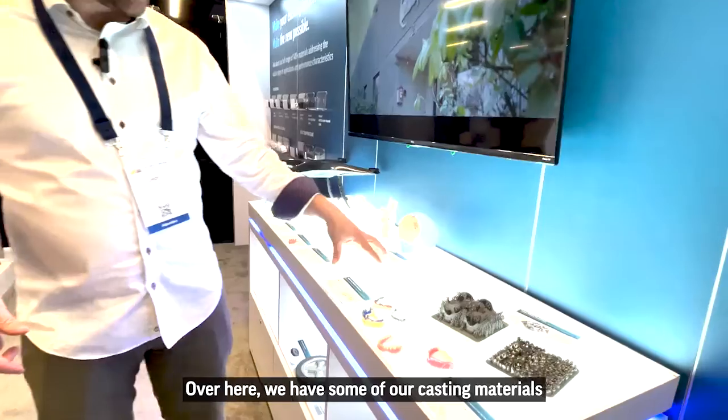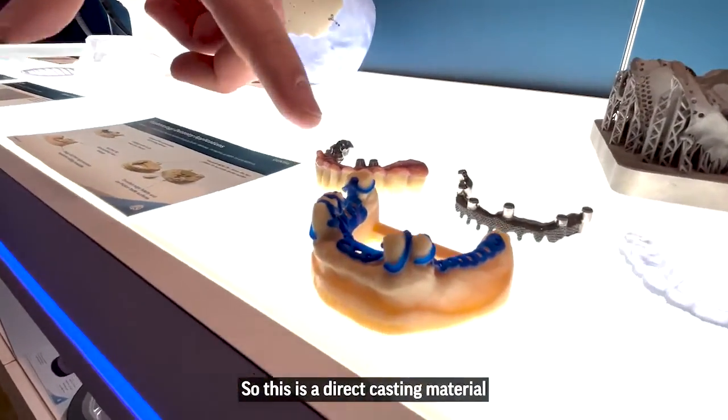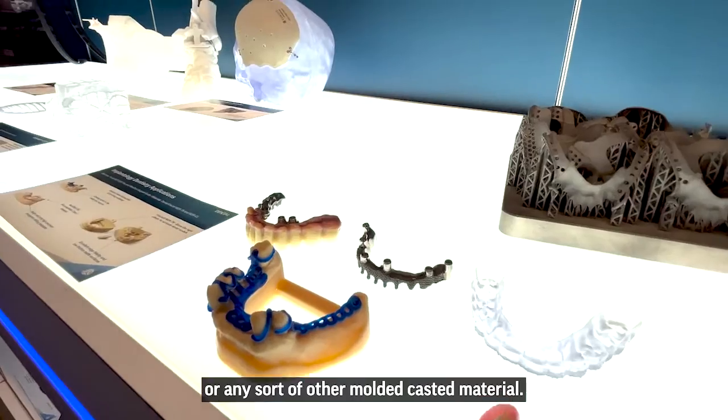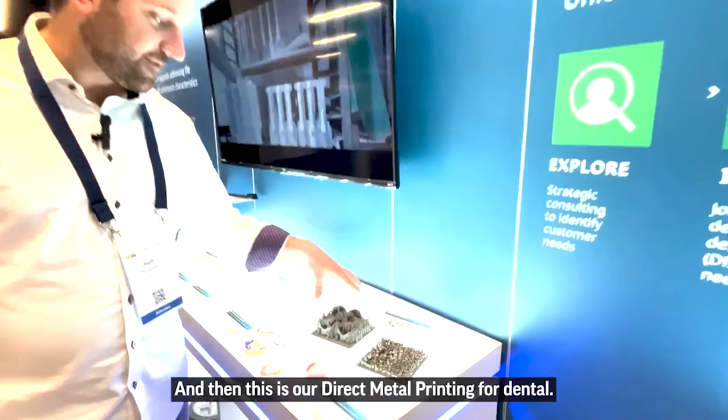Over here we have some of our casting materials as well as what comes out of it. This is a direct casting material that can be used in a dental lab to produce direct implant bridges or any sort of other molded, casted material. And then this is our direct metal printing for dental.